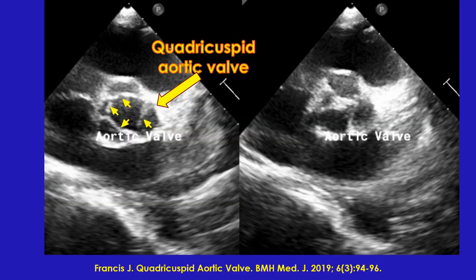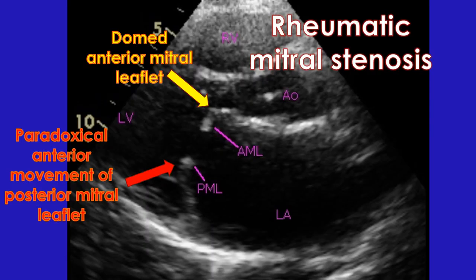Details about all four cardiac valves will be mentioned in the echo report. In case of the aortic valve, if it is congenitally abnormal, it may be bicuspid instead of the normal tricuspid valve. Very rarely, the aortic valve can also be quadricuspid. Morphology of the valves and their opening and closing will be assessed during echocardiography. Valve thickening and calcification are often noted in stenotic valves. Stenotic valves also dome while opening due to commissural fusion.